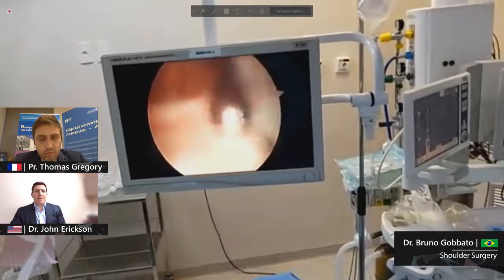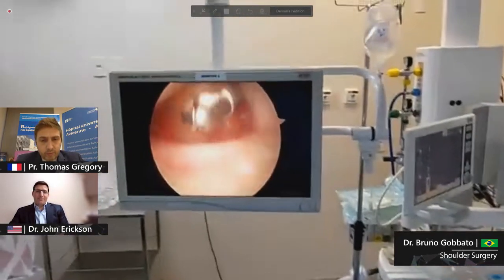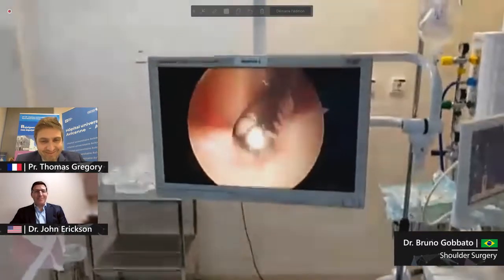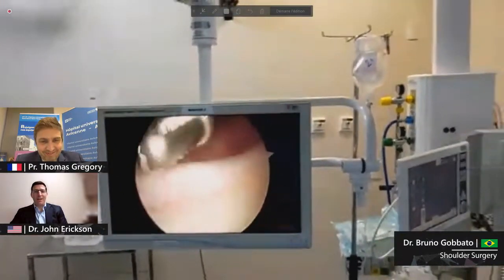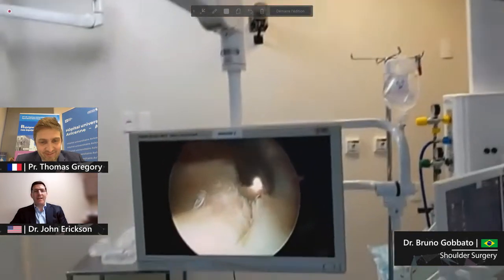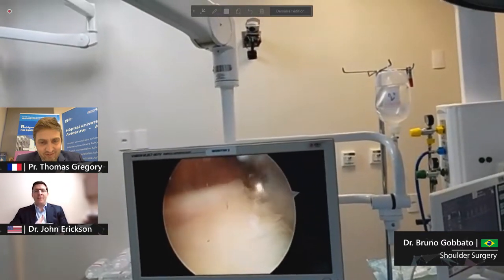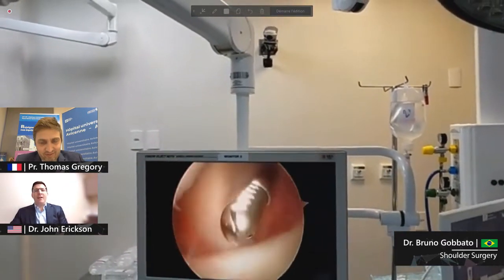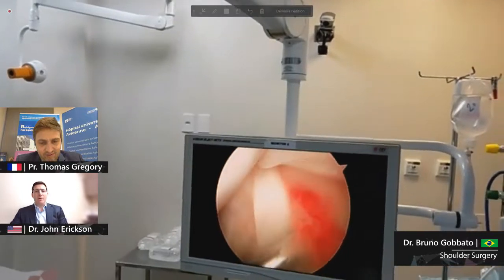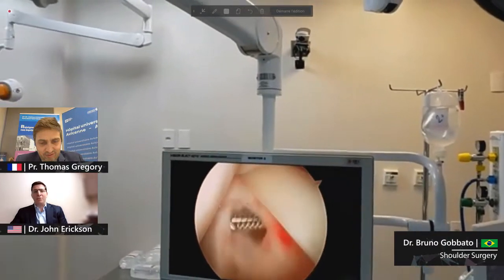John, what do you do when you have a SLAP lesion? Do you repair as a good American, or do you do a tenotomy as a good French? I'm biased by my French training, and also, fortunately, I published a systematic review on this, looking at the complication rates of patients over 35. You can have an excellent result with a labral repair even in patients who are older, but they do tend to have a risk of being stiffer. Some of the complications occur if you over-tighten someone, and many times you're dealing with a degenerative tear rather than an acute traumatic pathology. I think you need to be very careful of that.